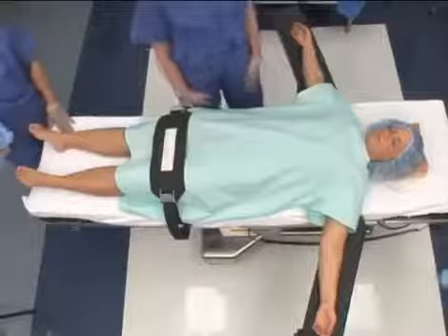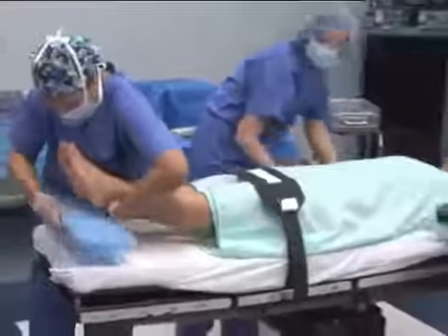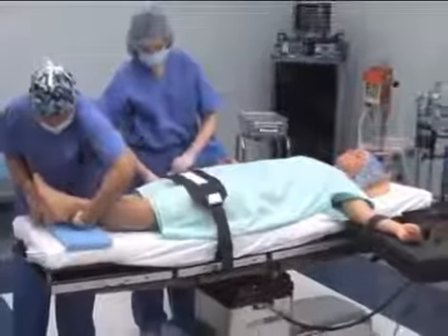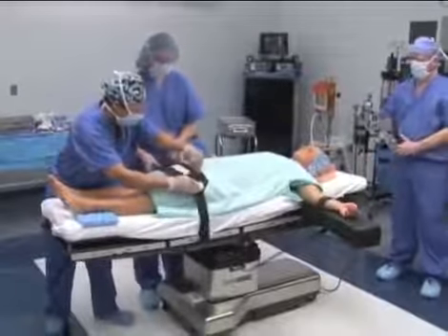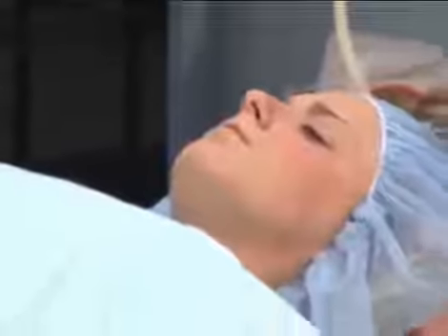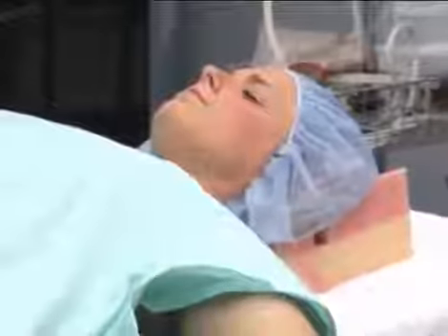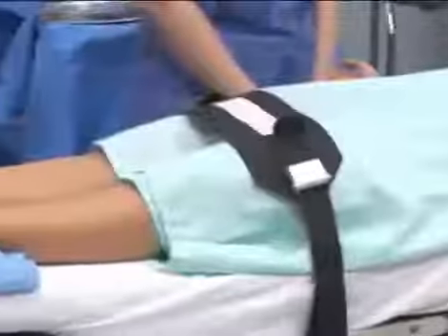The patient's feet must not extend over the edge of the table, and the legs must not be crossed one over the other. The patient's weight is distributed over the occipital bone, back, sacrum, heels, and posterior legs. Patients with spinal or pelvic malformation or total joint prosthesis may require special padding to support irregular curvatures and prevent hyperextension. A foam or gel pad is used to support the head. The safety strap is placed midway between the knees and thighs.